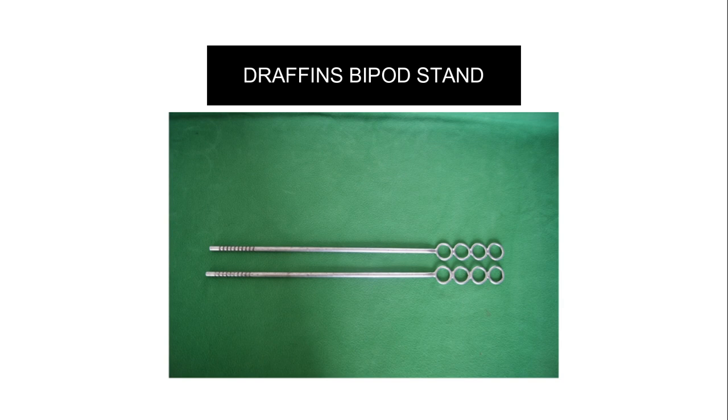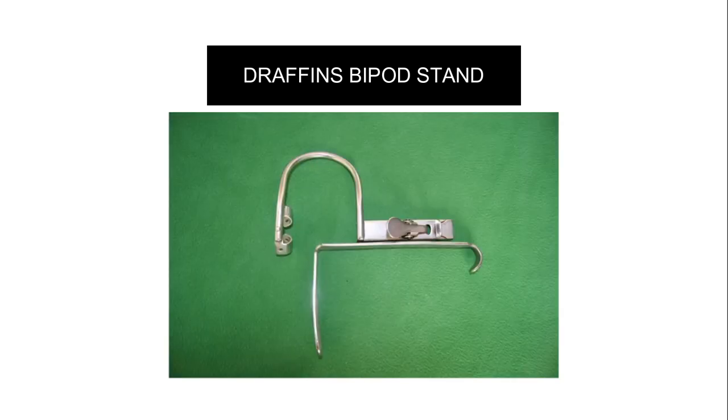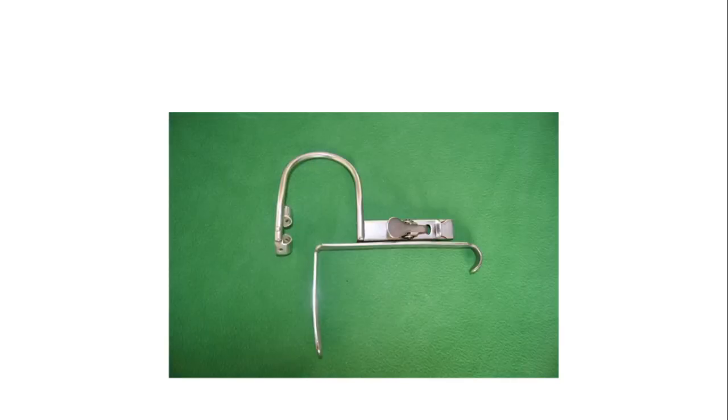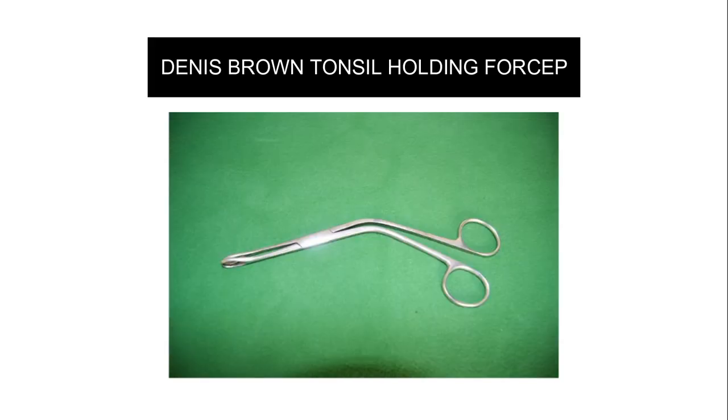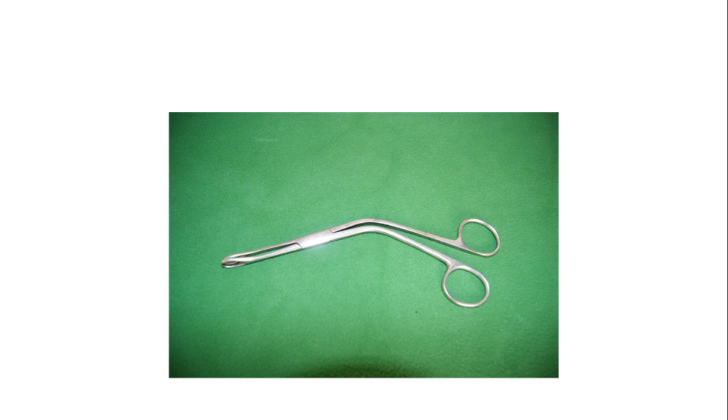This is the Draffin's bipod. Going back — this is the Boyle-Davis mouth gag, and this is the tonsil holding forceps. We move it in between the tonsil and the anterior pillar so that we get a plane between them, where we make an incision between the anterior pillar and the tonsil.